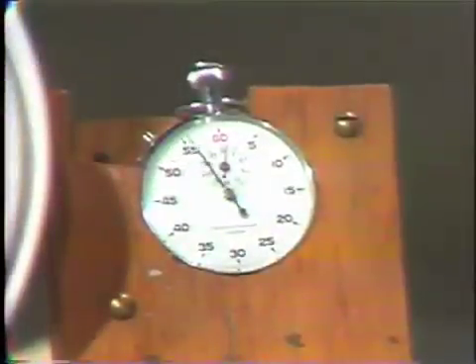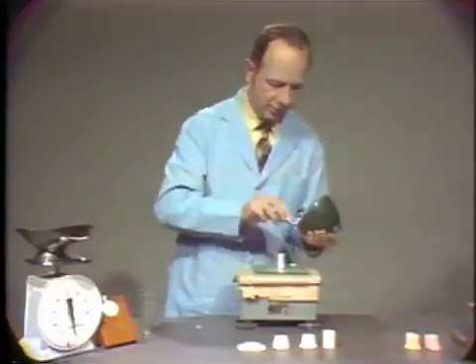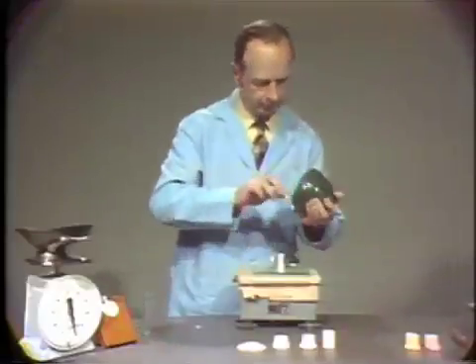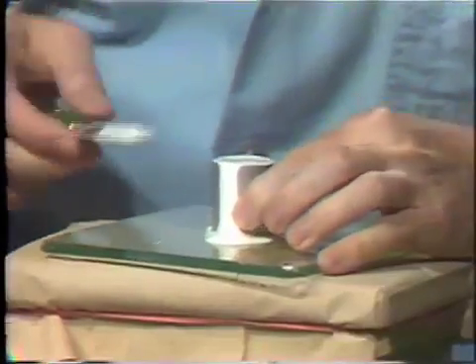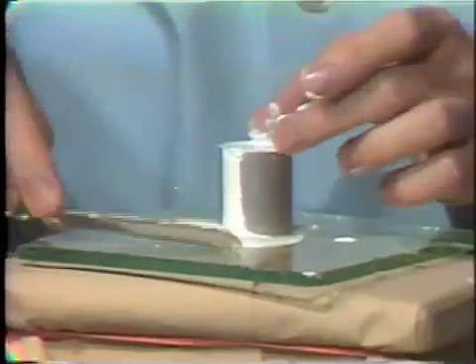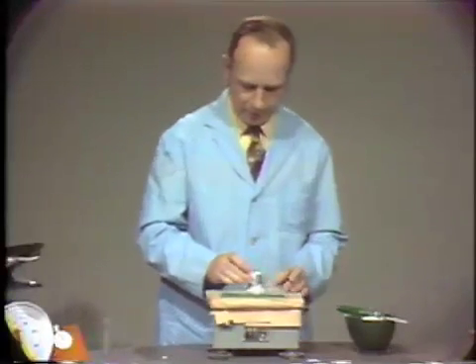We're nearing the completion of the mixing time and we will now take some of this material and pour it into the small metal ring that we have. We'll vibrate this slightly. This will tend to remove the air bubbles. We'll try to remove some of this excess material around the base. And now we'll remove the ring from the material.